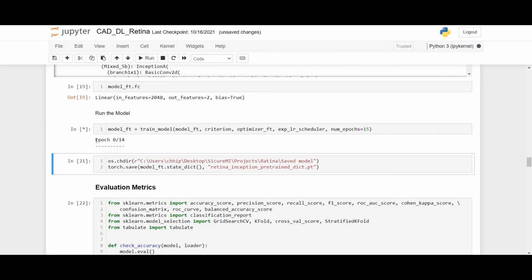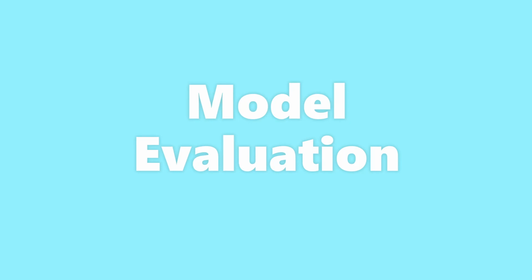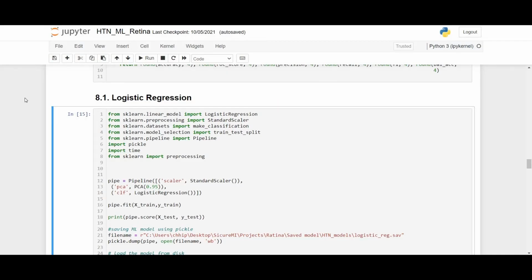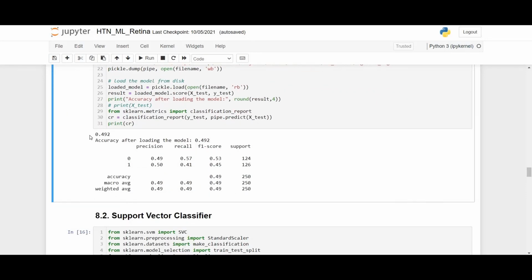After following all the steps we have trained both the machine learning and deep learning models of the Retina Hypertension project. To see the performance of the model, we can have a look at the classification metrics for the machine learning model. We can see the precision, recall, F1 score, and accuracy of the model in the classification report. For class 1, hypertension, precision, recall, and F1 score are approximately 50, 41 and 45% respectively.